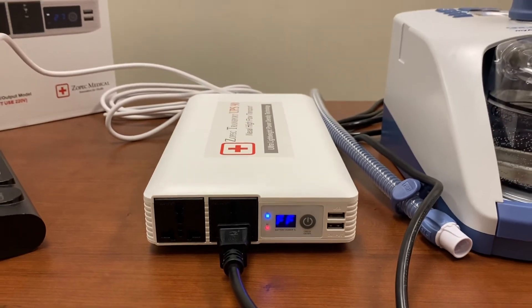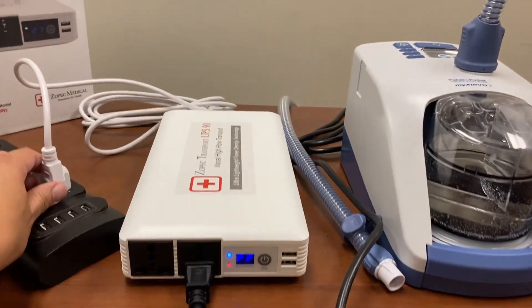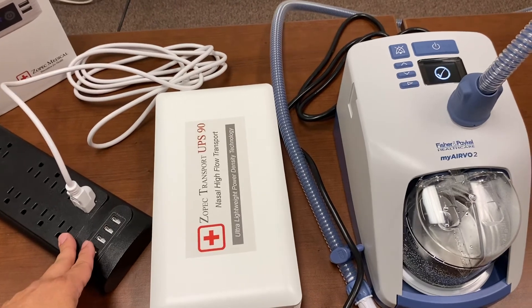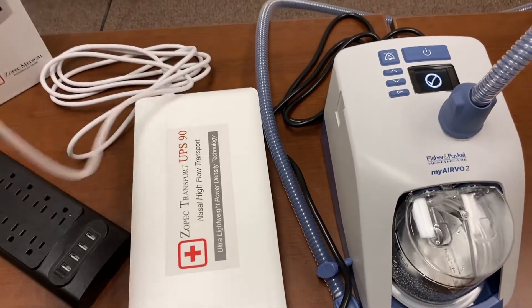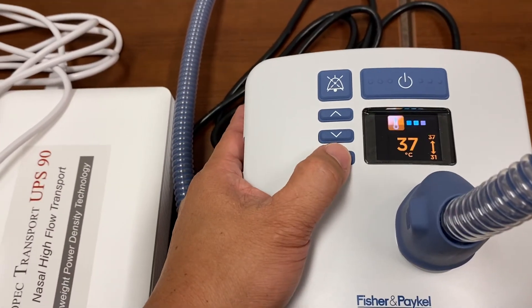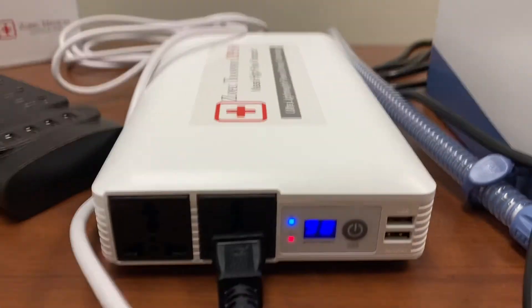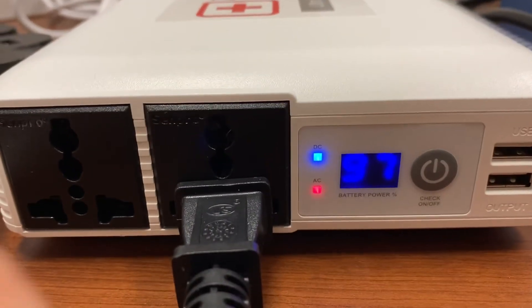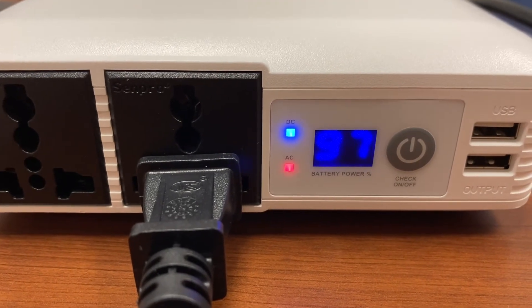Let's pretend we're transporting. The key is that we are going to unplug the UPS and we shouldn't see any interruption of the AirVo 2. Ready? One, two, three. You can see that the AirVo 2 continues to run — there is no interruption to the therapy at all. The AirVo 2 is running with the battery now, and the battery is starting to drain.